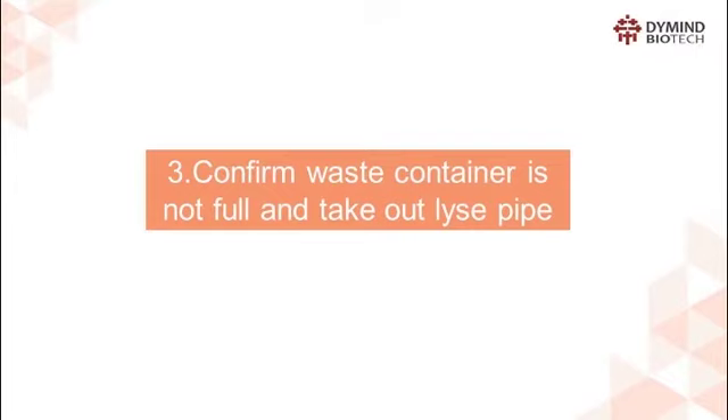Step 3: Confirm the waste container is not full and take out the lyse pipe.